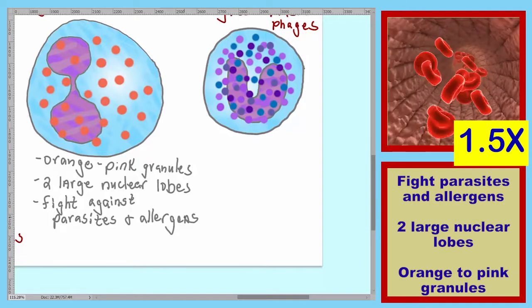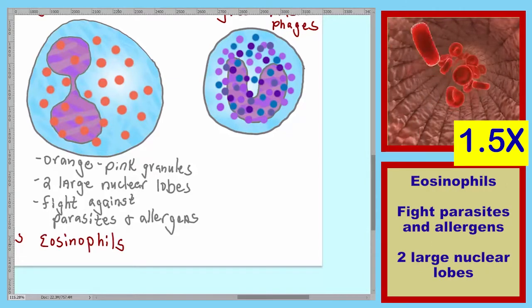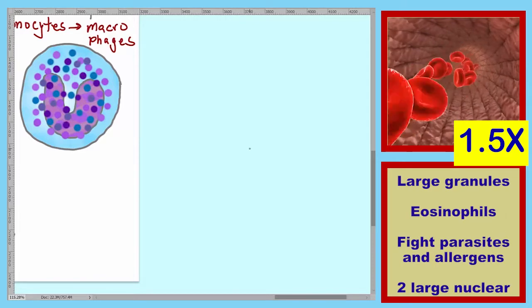These cells are known as eosinophils. And that completes our description of the eosinophils. Let's move next to our last formed element. Okay, first let's describe what we see. These cells have large granules, and we will indicate what's in these granules.